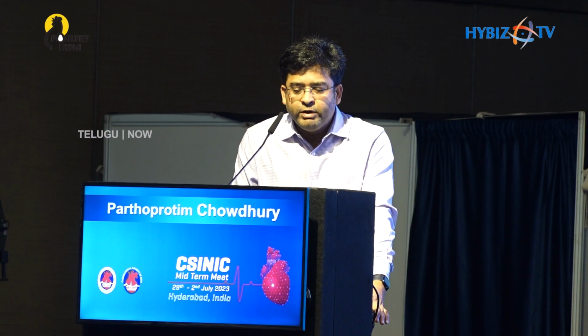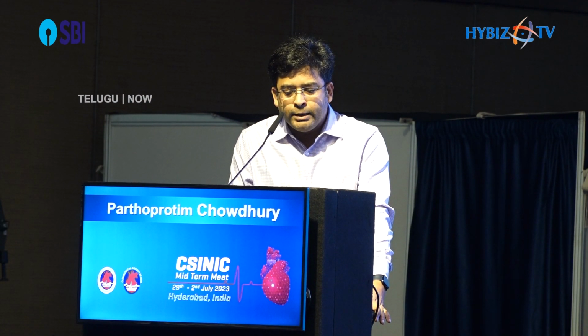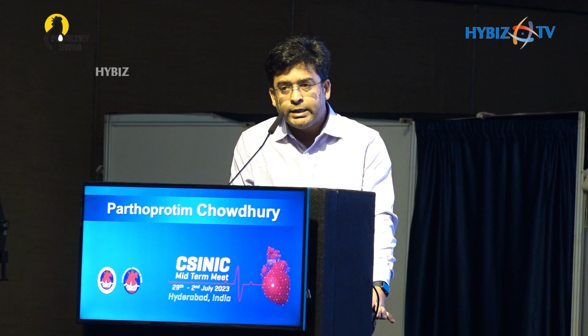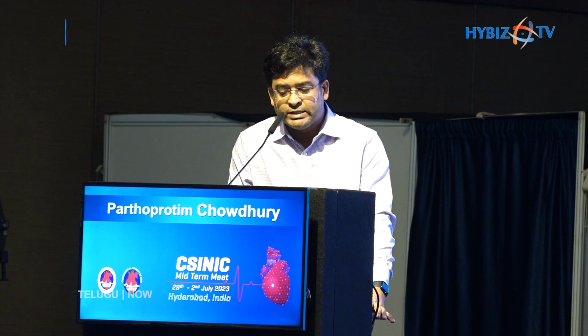Now that was a theoretical approach. This is a more practical approach. When we are encountering such cases in the cath lab, if it arises just next to the LM, use a simple JL. And if it is above or below in the aorta, you can use an Amplatz. If all this fails, one very good method is to engage with the help of a TIG or a diagnostic catheter, put in an exchange length wire, then track a 6 French guide cath over the wire.